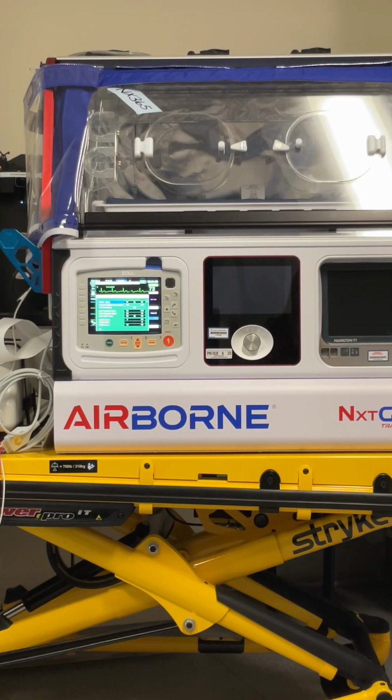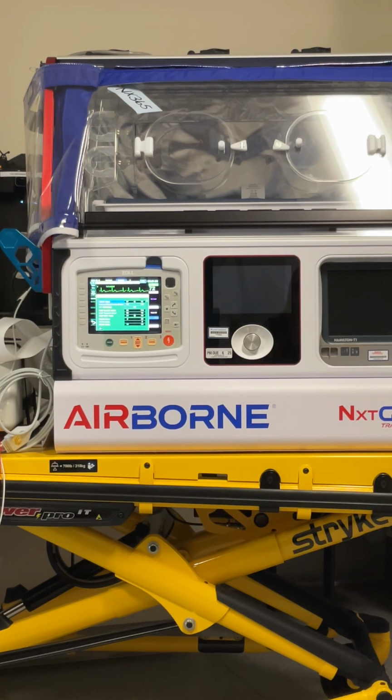So once you get everything hooked up on your patient, come in here and hit stat set, and it dials that monitor to that patient. It does the same for the SPO2? Yes. And it's only when the alarm is active. Whatever you have connected to the patient, it will adjust those settings. It doesn't turn on any alarms, but it will adjust those alarms 20% above and below. All the alarms that are connected. Yep. Make sense?